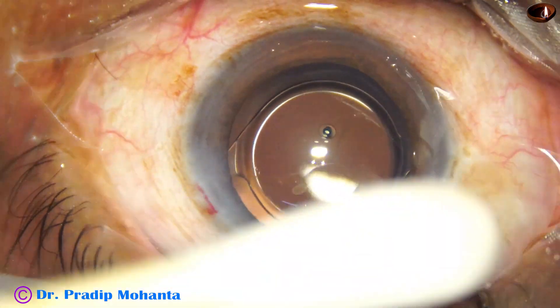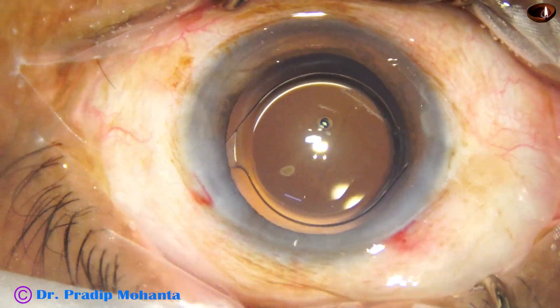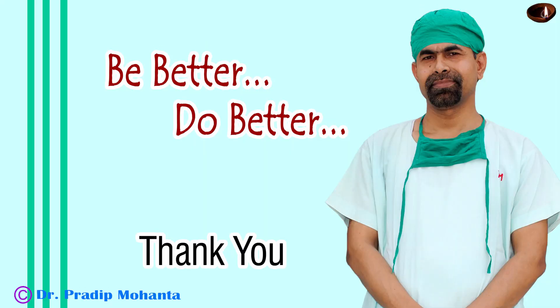A few drops of antibiotic are applied over the ocular surface and the case is concluded. Thank you very much for your attention. Hope this video will help you in developing your surgical skills. Be a great surgeon and serve your patients with love, respect, empathy, and great surgical competence.